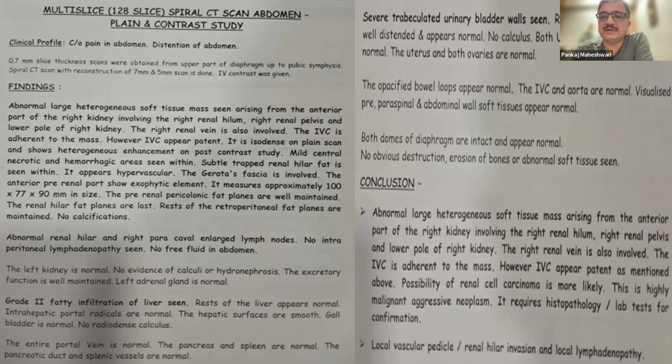Second, DTPA renogram would be needed in patients who have borderline elevated creatinine to look at the opposite kidney. And it may be needed post radical or partial nephrectomy to look for residual renal function.